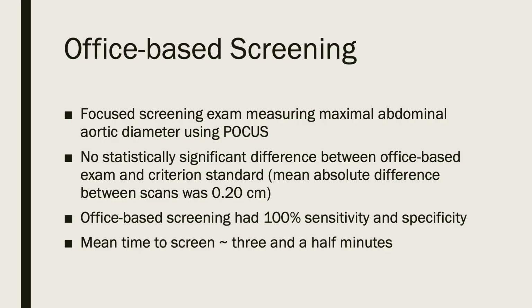The office-based screening had 100% sensitivity and specificity, and interestingly, the mean time to screen was only about 3.5 minutes, which is why I chose that time frame to conduct my own screening exam. 3.5 minutes is not too long, and it makes conducting an office-based screening feasible when we consider how busy an outpatient family medicine or internal medicine practice is.